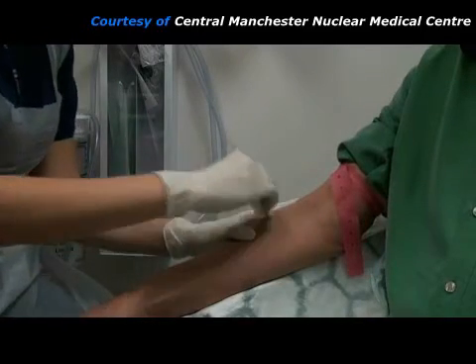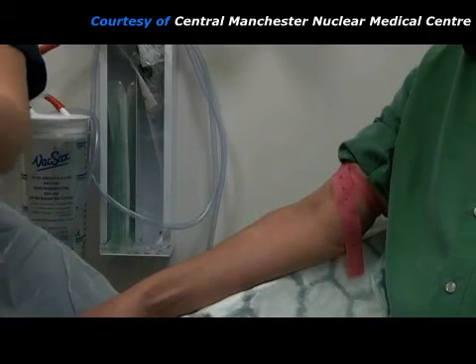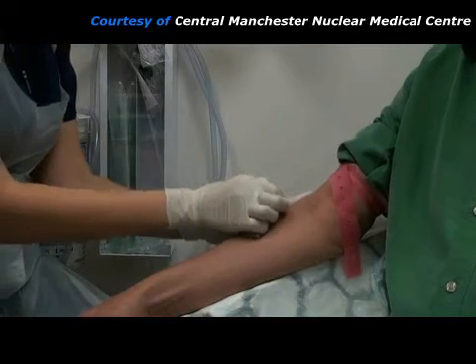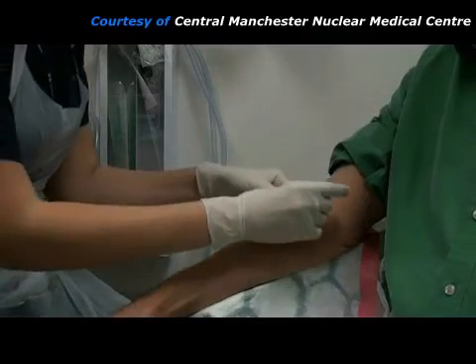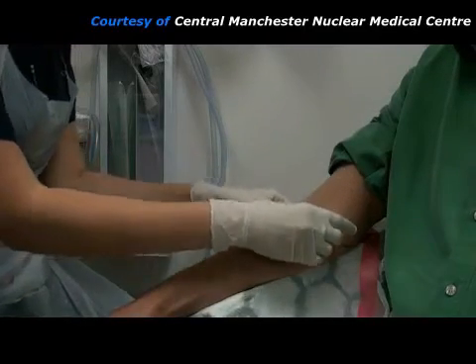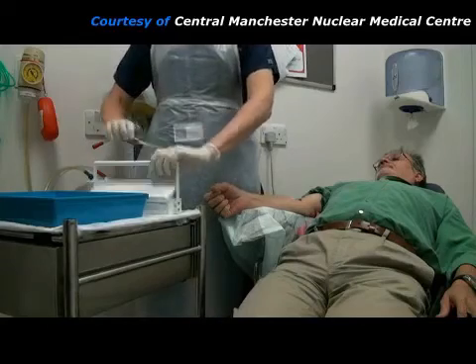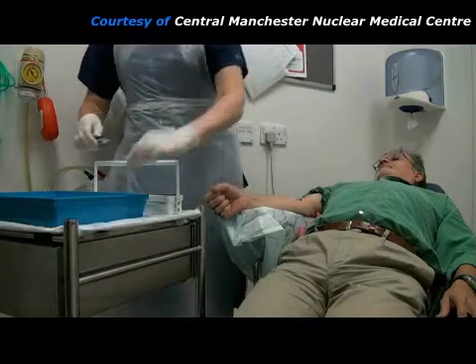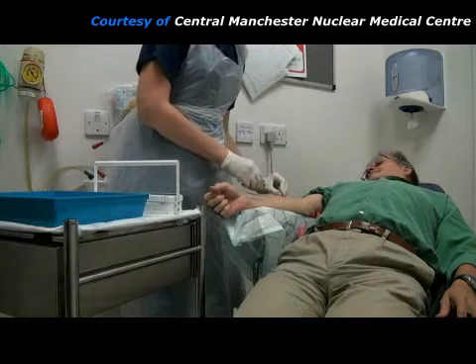The practitioner inserts a small needle into a vein in the patient's arm. The needle is attached to a short plastic tube through which an injection can easily be given. The injection is kept in a lead-lined box and the syringe is shielded with lead to protect the practitioner's fingers from the radiation.